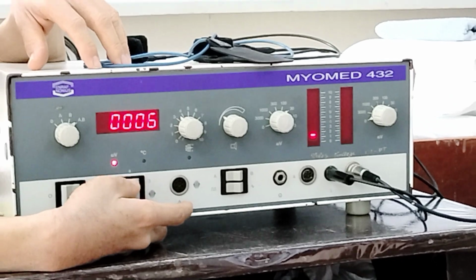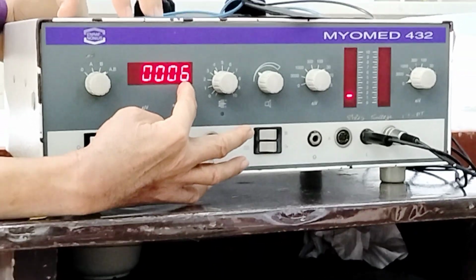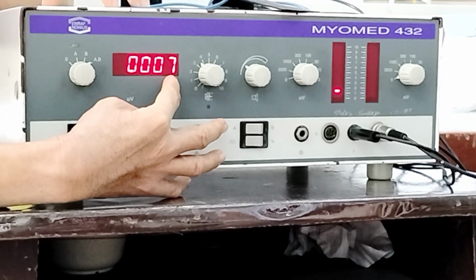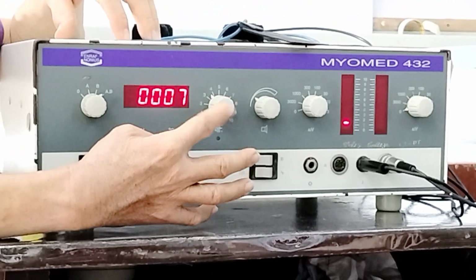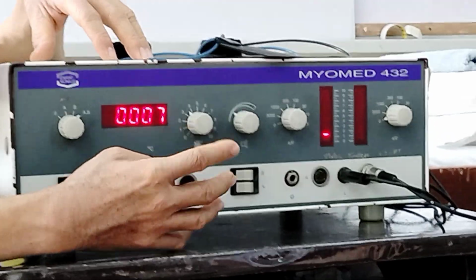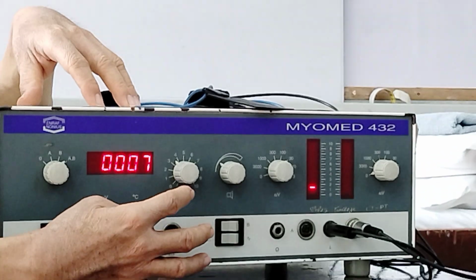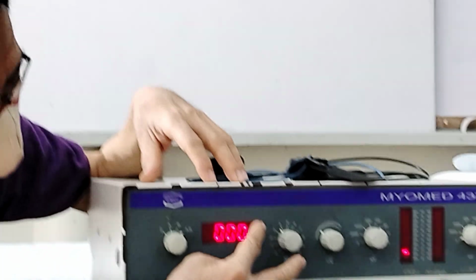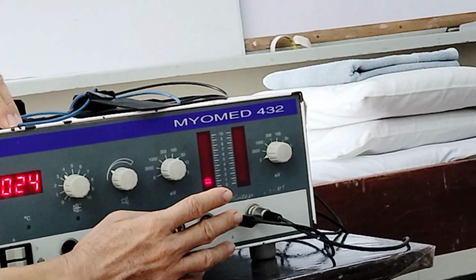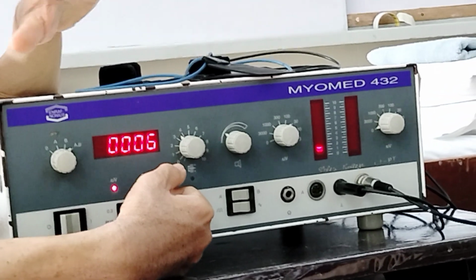So here, if you place this to 0.3 second, it will indicate that if there will be changes in the signal, it will change every 0.3 second. If it does not note any changes in the signal, it won't change, it stays steady. If it notes changes, it will change faster. So here, the changes are fast.